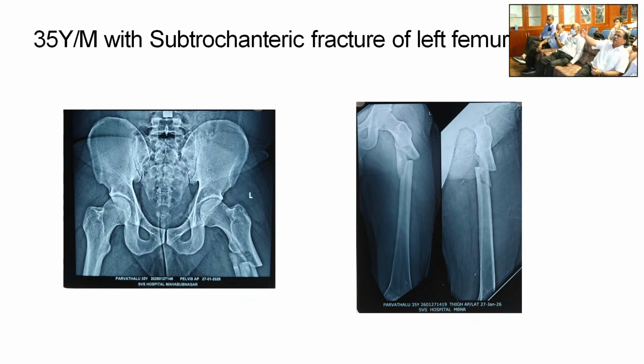Because it's designed in such a way, it's a bowing. So if we take a bit lateral entry, we won't achieve any reduction, sir. Why can't you get a correct reduction with a lateral entry? It won't correspond to the medullary canal, sir.